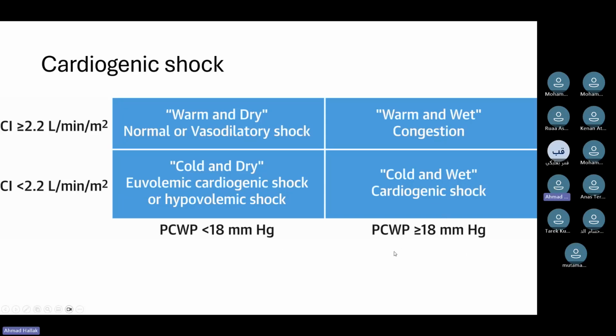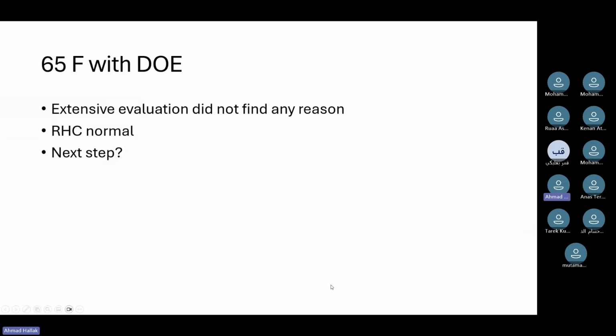One of the biggest things that determine the patient's long-term outcome is not necessarily what the wedge pressure is, it's the inability to decrease the wedge pressure with diuresis. It's not necessarily how high the wedge pressure is. It's, after diuresis, were you able to get the wedge pressure back to normal? If you were able to get it back to normal, these patients have a better outcome than the ones where, even with extensive diuresis, you were not able to improve the wedge pressure.